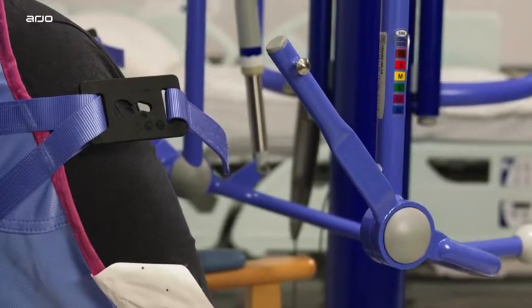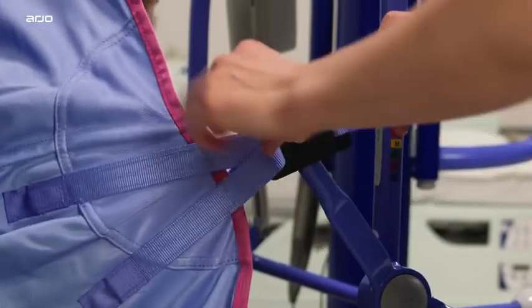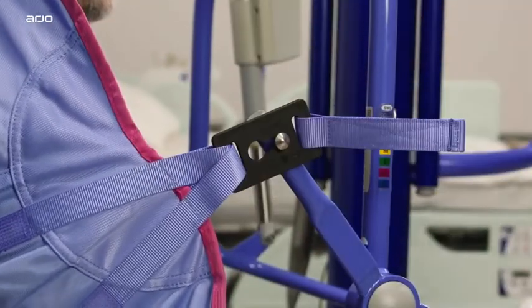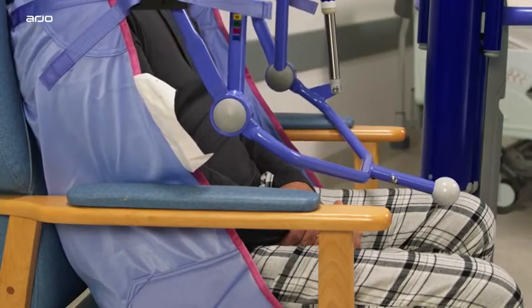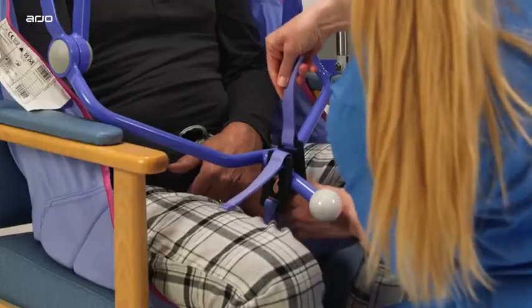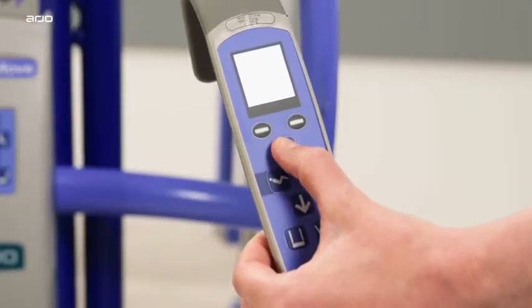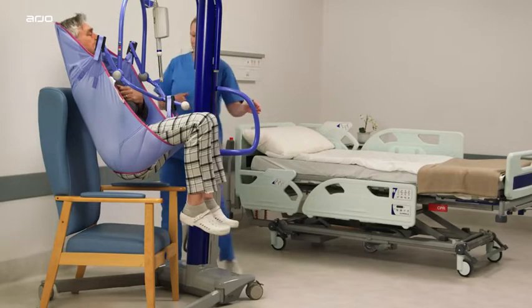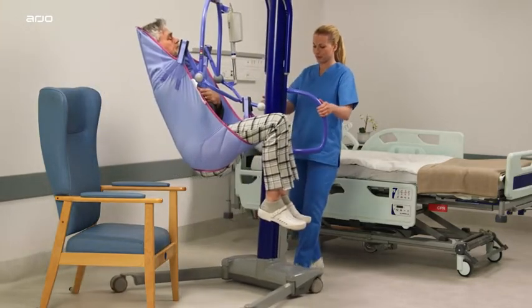Once the MaxiMove is in position, attach the shoulder strap attachment clips to the sling attachment lugs on the spreader bar, and attach the leg strap attachment clips. Lift the patient using the handset control, then move the lift away from the chair.